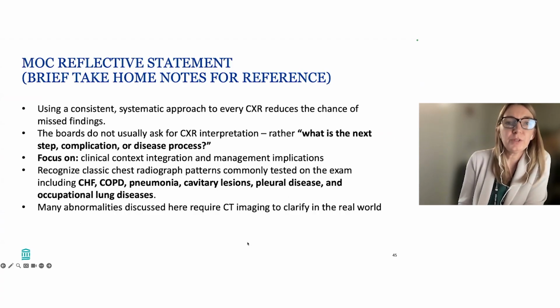So, brief take-home notes. Using a consistent, systematic approach to every chest x-ray reduces the chance of missed findings. The boards do not usually ask for chest x-ray interpretation. Rather, they ask what is the next step, complication, or disease process. You really want to focus on clinical context integration and management implications of what you're seeing in the chest x-ray.